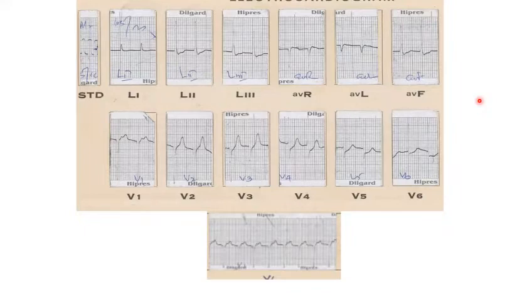You have got a point that there is a possibility that the patient might have had a previous anterior myocardial infarction. But I will be very diplomatic, because there is no ST change, no T wave change, nothing. So sometimes you can get a QS pattern in V2 also, but keep your mind open that this patient might have had a previous anterior myocardial infarction from which he has recovered and healed. That's all right. Okay, yes.